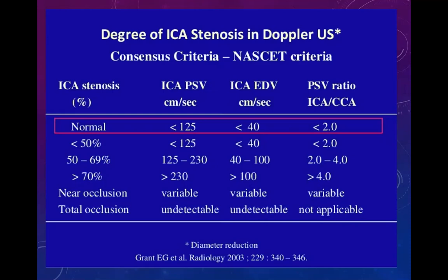As you utilize the ultrasound diagnostic tool, we have to develop our own standard according to your own institution, according to the machine you utilize. So those are things of critical importance.